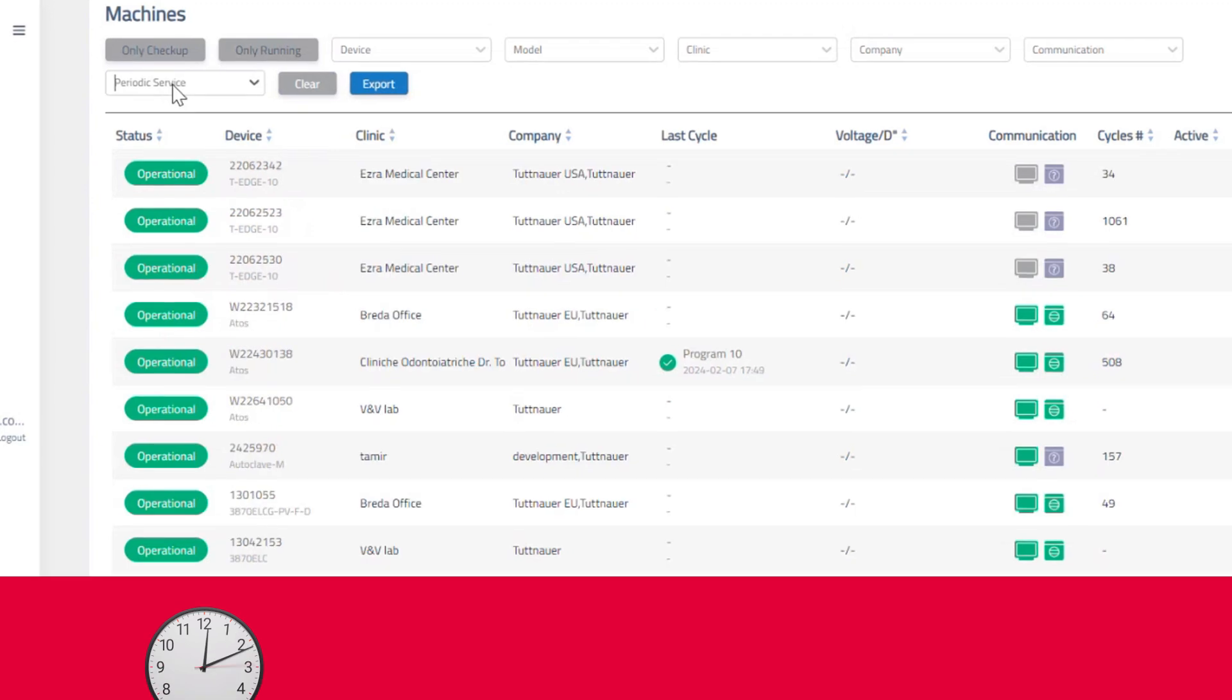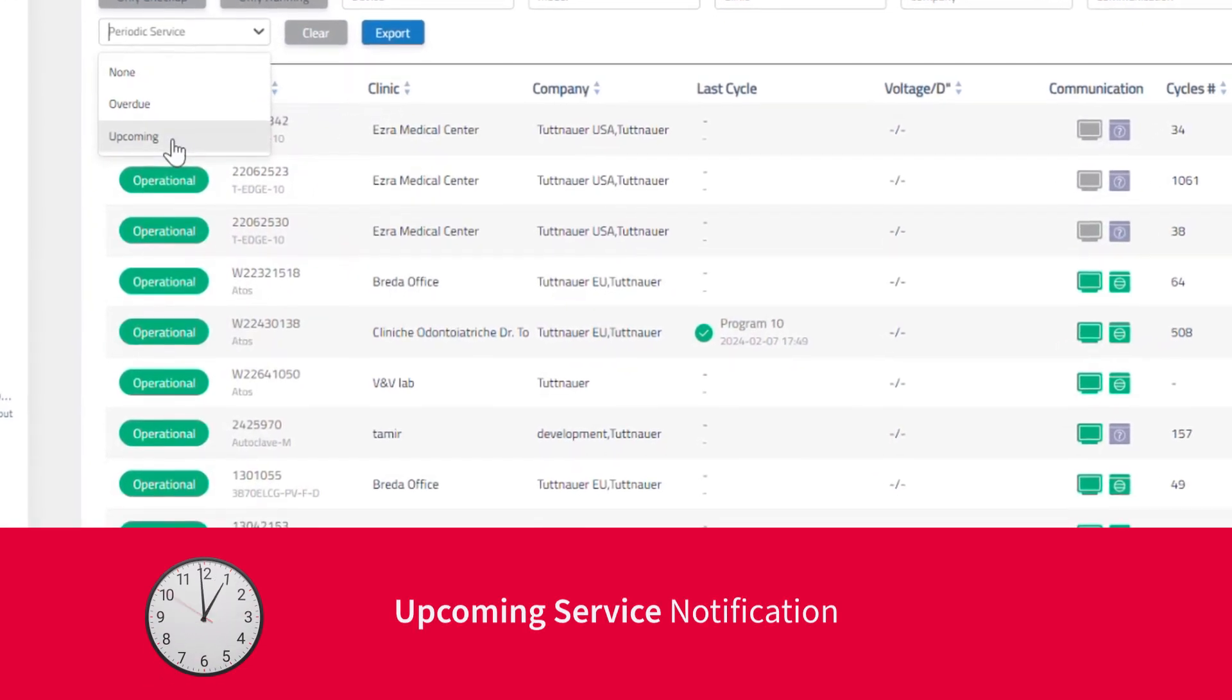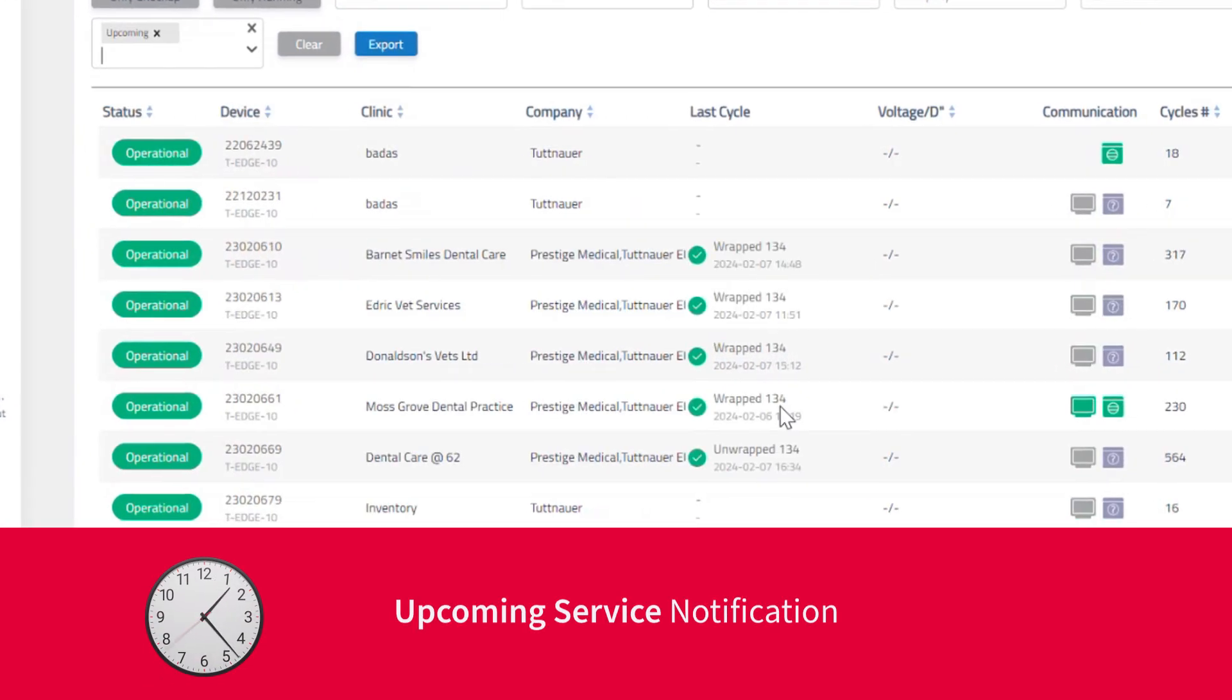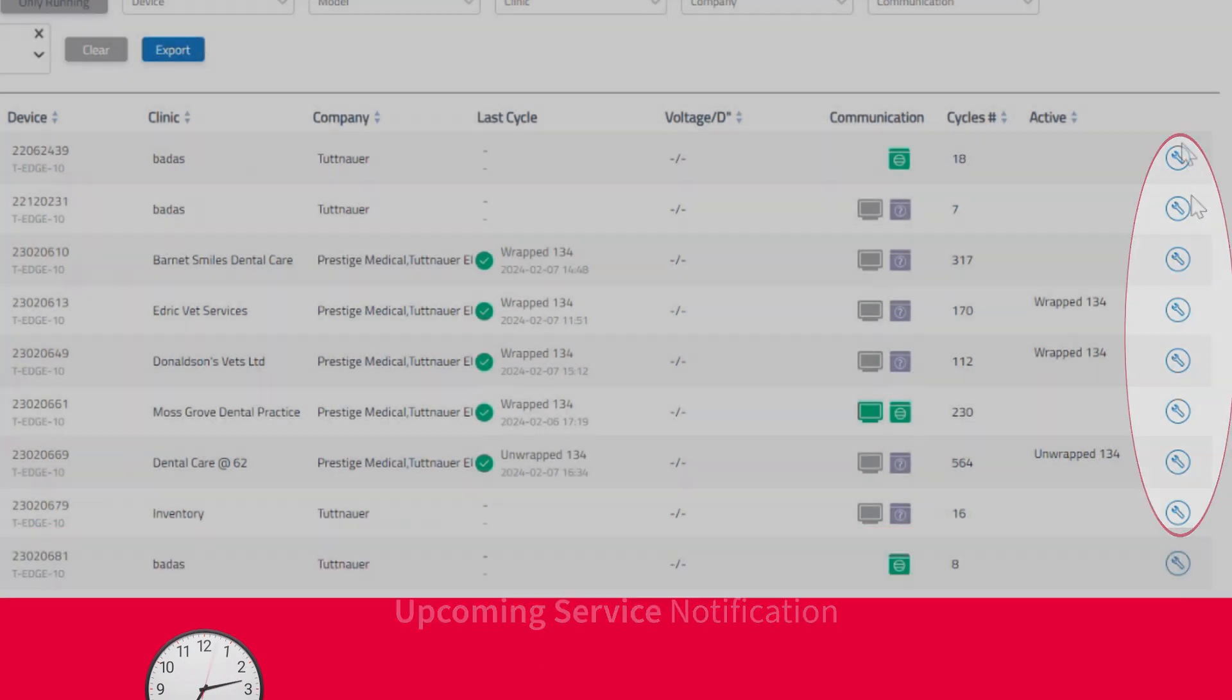Manage your time and customer visits by reviewing all devices that will require upcoming service maintenance.